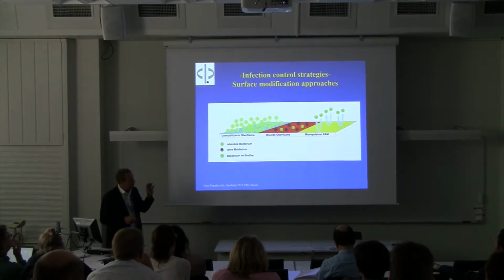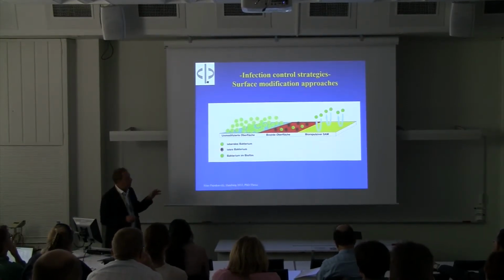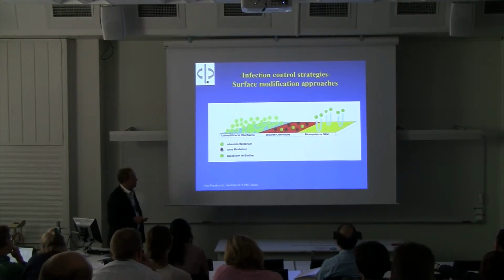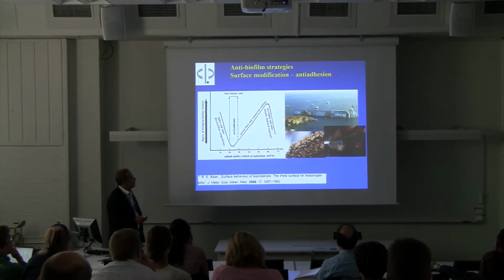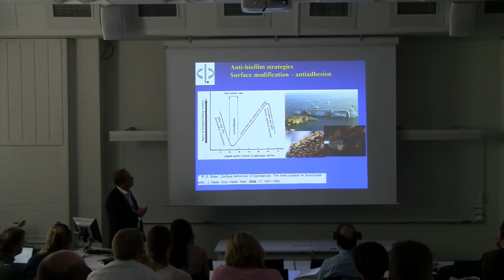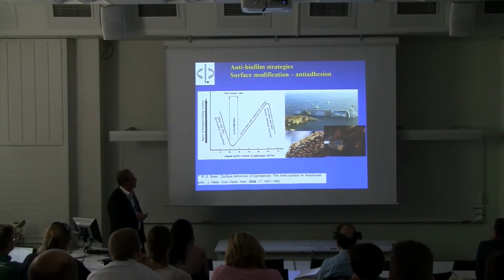And for the development of any antimicrobial material, you have two general directions. The first is to create a killing, biocidal surface, killing bacteria by releasing antibacterial drugs, or to create a surface which is smooth or anti-adhesive, repulsing all the bacteria. The first attempt, the anti-adhesive surface, has a theory for it. It's the low energy theory, and we know that particles do not adhere really if a surface has a very low surface energy, like silicone or Teflon.